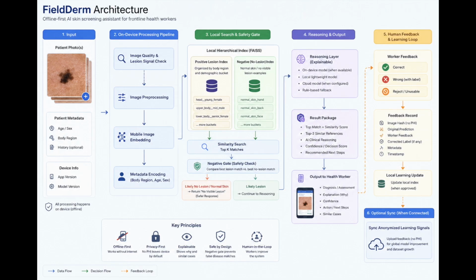Those images will be fed to the model, and the model will try to do some reasoning on them and understand the similarity scores, some clinical reasoning, and how confident it is in the solution. Once it gets the result, it will be shared.